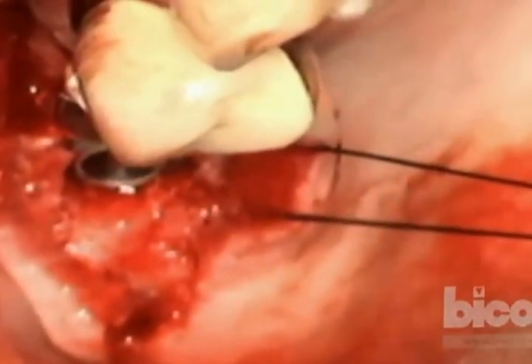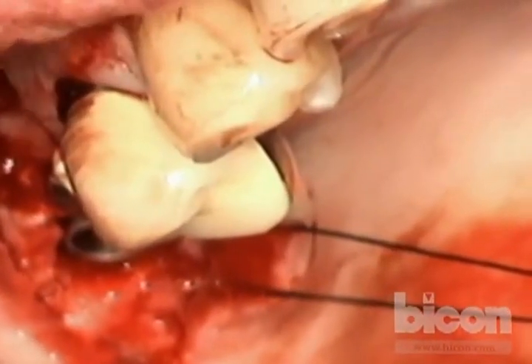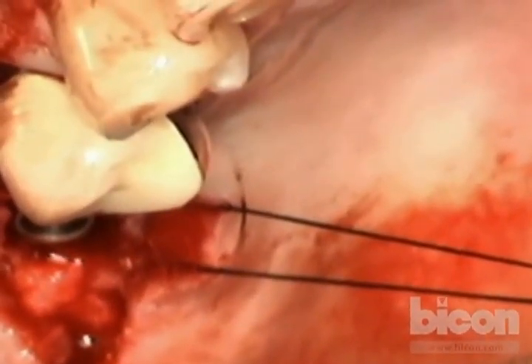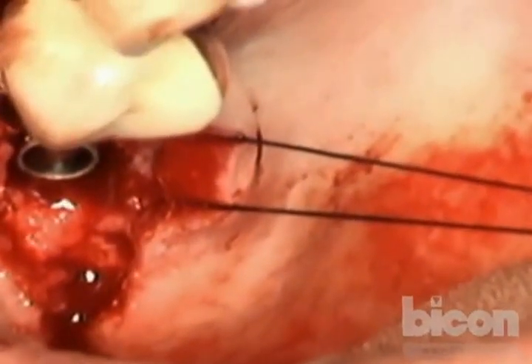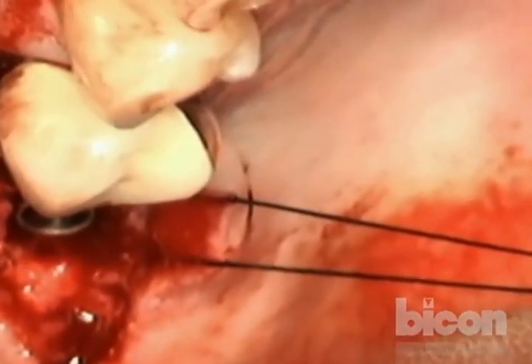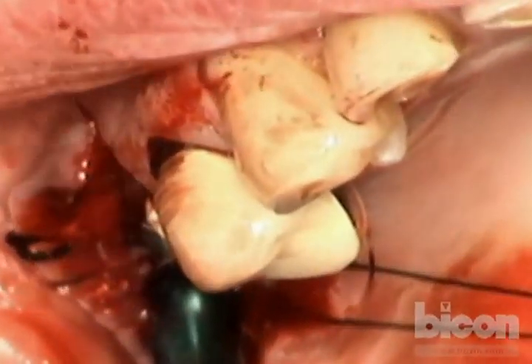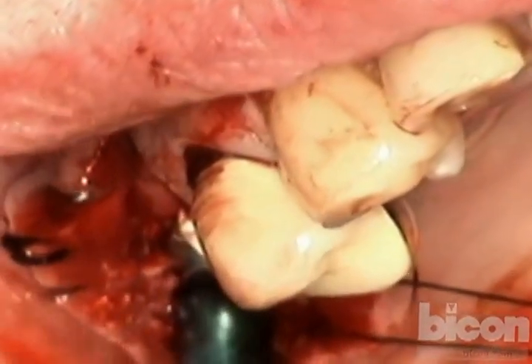Okay. Good. The two implants will be a little bit closer together and a little bit farther from the mesial healed implant because of just the nature of the movement of bone, the nature of the flap design and so on for protection of the sinus. There is not much we want to really change about that. What we really need to do is make sure that they are placed at the proper depth, because with the Bicon implant design, that the two implants are close together is not a big deal, and that they are far from the neighboring implant also is not going to be a big deal.